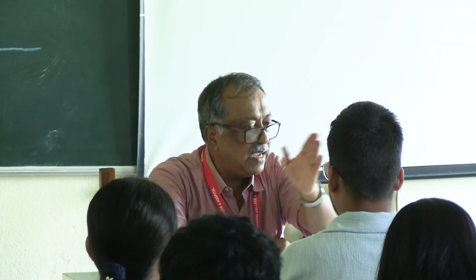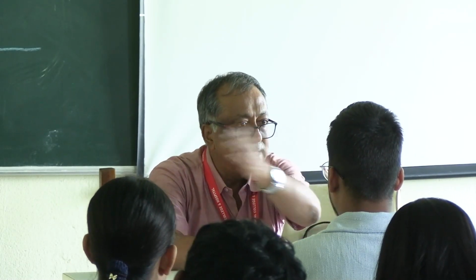At 1024 the frequency is higher, the decay is higher, quicker decay.